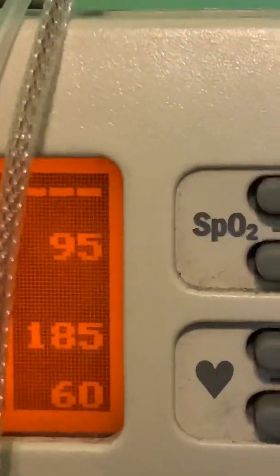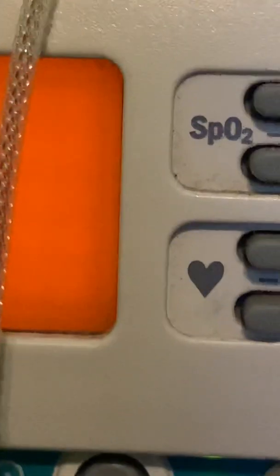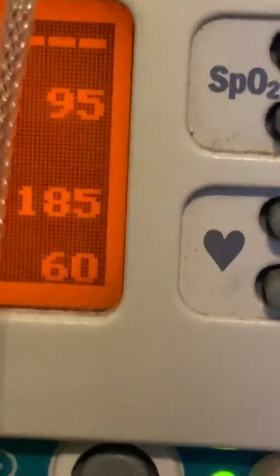This right here is the contrast adjustment. If I slide it left, the screen gets darker. If I slide it right, then the screen gets bright — but then you can't see it. I'm going to set it like this.